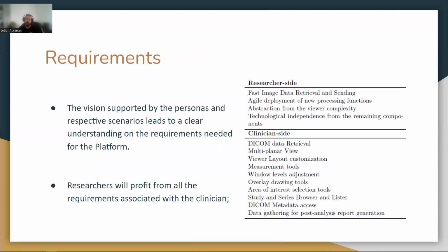To support the vision described above, it is important that the proposed platform provides the clinician with a set of tools that are common to the cardiac workflow, and also having mobility as a main feature, because having the personas archetype in mind, accessing exam images and data anywhere is highly useful. It's a highly useful feature which will improve the capabilities of co-working and cooperating with colleagues.